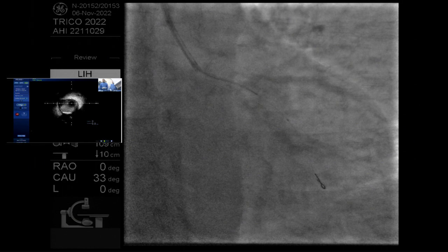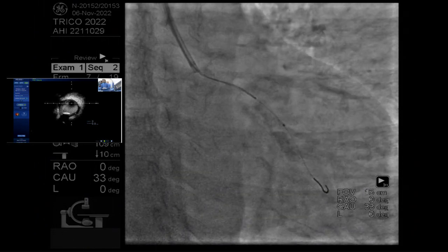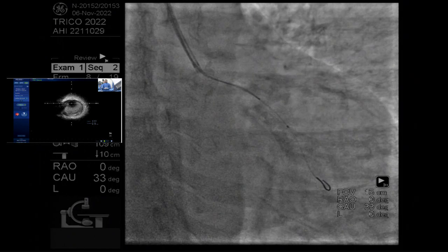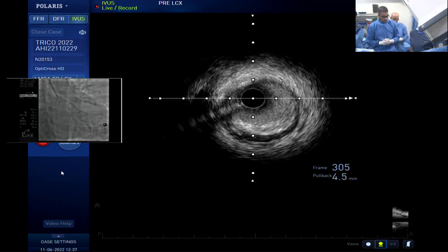Okay, so cine here, just short cine here. You're in the circ here, right? You can see that's good. Okay, now let's go on to pullback. Okay, and we can focus on the IVUS if we can. Get the camera onto the IVUS, please. It is there. So as you pull back, you can see that there really isn't much in the way of disease here. Just fluoroscopy so we can see where the IVUS catheter is.